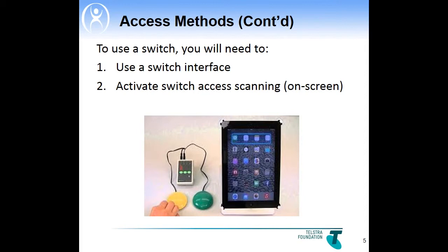While there may be different reasons for using scanning, the most common is a physical disability resulting in reduced motor control for direct selection. Communication during scanning is slower and less efficient than direct selection, and scanning requires more cognitive skill, such as attention. Scanning using technology has an advantage to allow the user to be independent in controlling the assistive technology for those with only one voluntary movement.